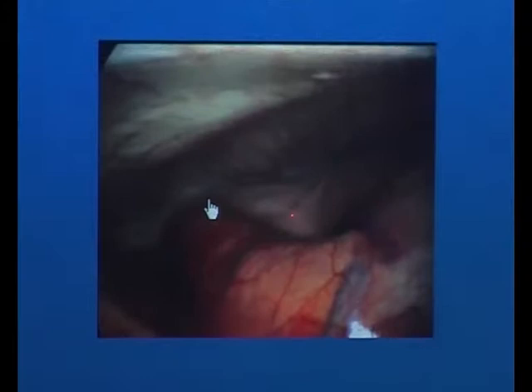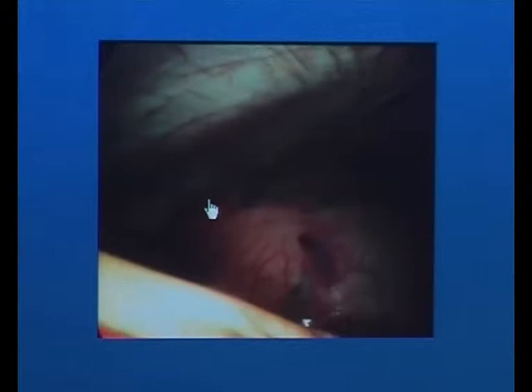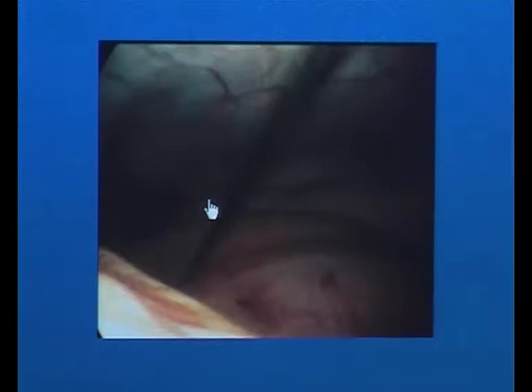So, now we can bring the toggle into the lumen and then deflate the abomasum. If you bring air into the abomasum now, it's difficult to fix it correctly in the lumen. Perhaps we puncture the abomasum and a structure behind the abomasum. So before bringing the toggle into a not displaced abomasum, bring a little bit of air into the abomasum to get a correct position of the toggle in the lumen of the abomasum. Now we deflate the abomasum and can remove our instruments.